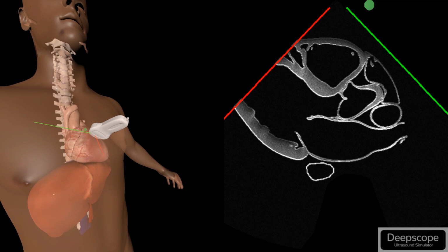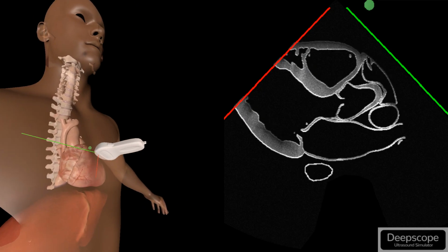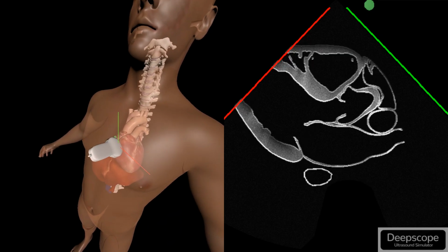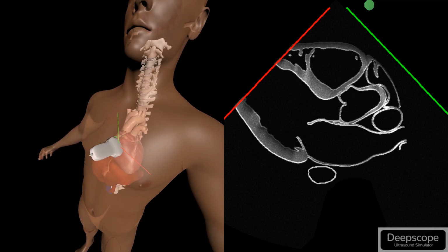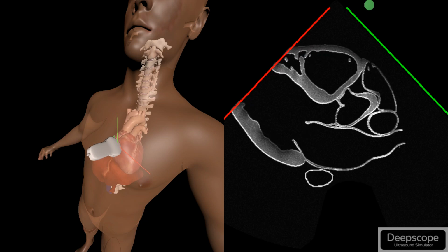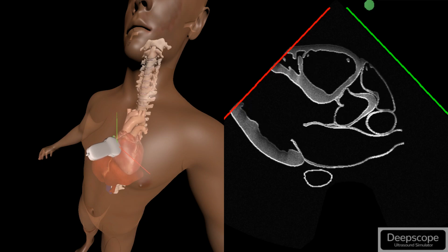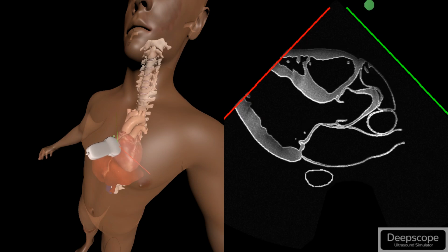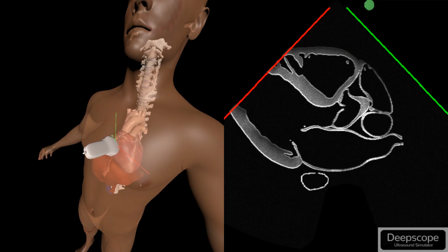I am recording a test tutorial on how to optimize PLAX views. And in this recording and tutorial, we're going to be talking about how to fix a capped image and how to identify what a capped left ventricle appears like. In addition, we'll talk about the normal motions needed to adjust for the presence of papillary muscles.